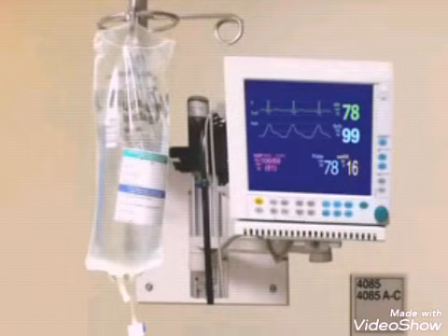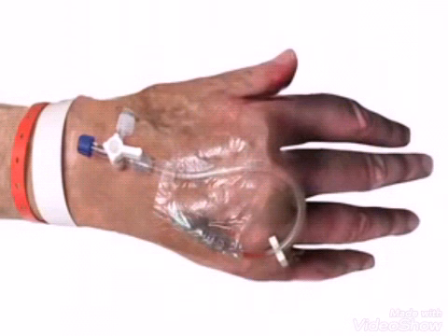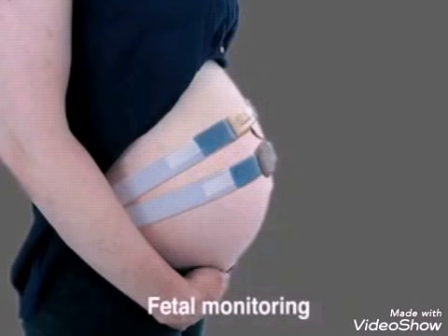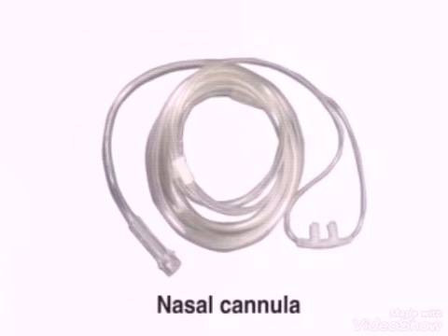At a minimum, blood pressure should be monitored non-invasively, pulse oximetry should be performed to monitor oxygen saturation, and intravenous access should be obtained before initiating the procedure. Pregnant women may require fetal monitoring. For most patients, anxiolytics and analgesics can be administered as needed. In patients who receive sedation, supplemental oxygen may be needed.